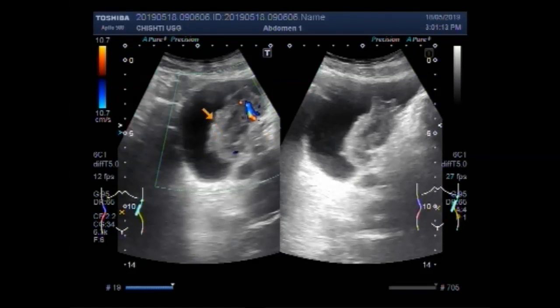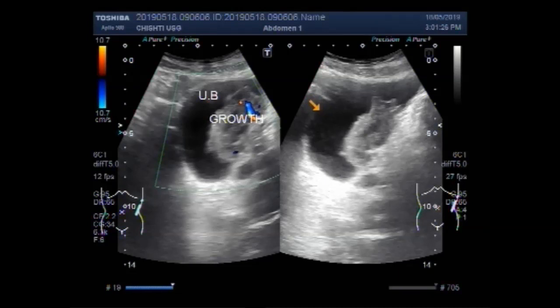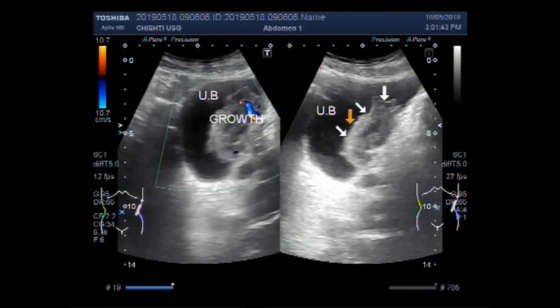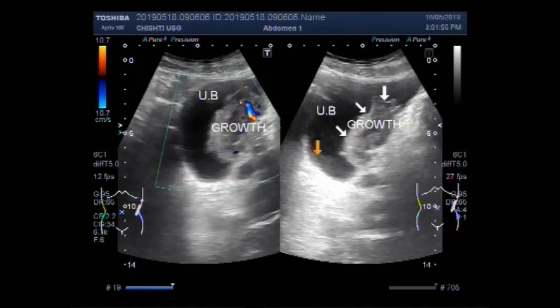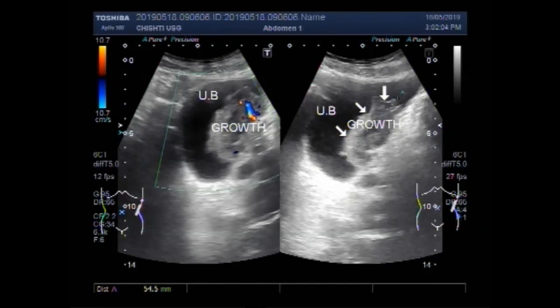This is the growth, this is the urinary bladder, and this one is the growth along the right lateral wall of the urine-filled urinary bladder. The mass measures about 5.5 by 2.7 cm.